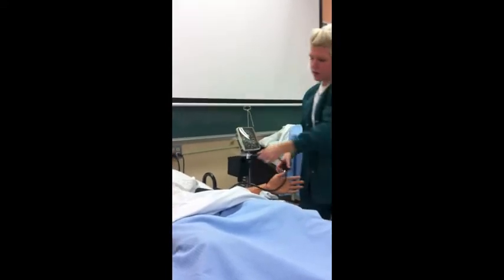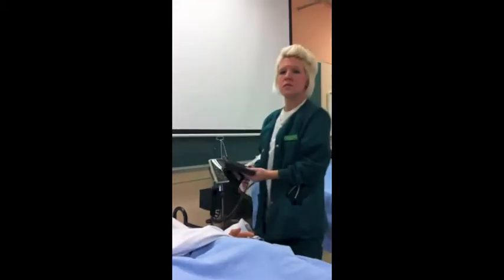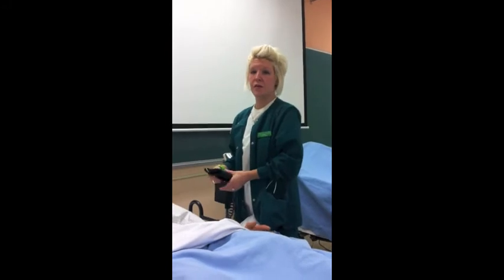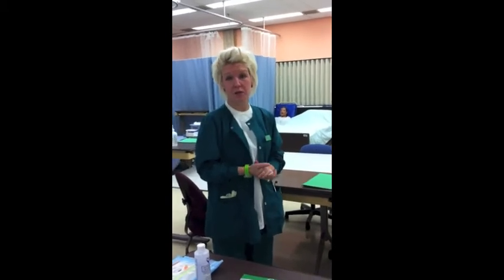And my patient's BP was 122/76, which falls within normal range. I took an oral temperature of my patient, and the patient's is 98.6, which is normal temp as well. So again, today I'm going to be changing my patient's colostomy bag.